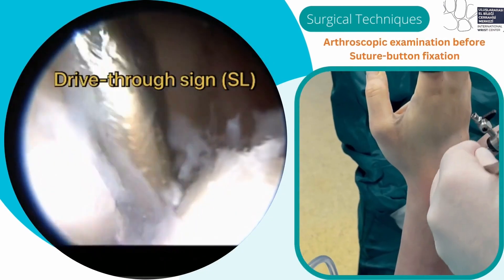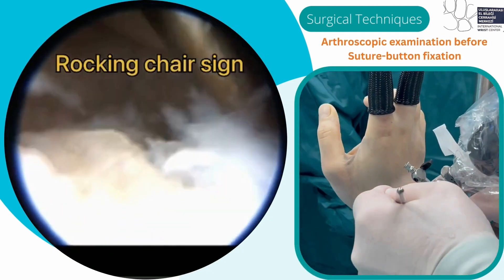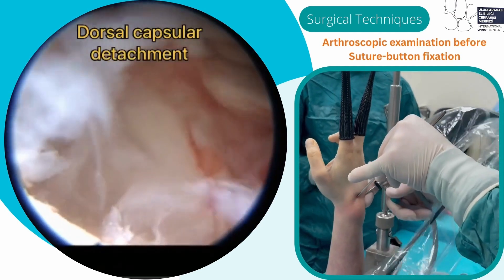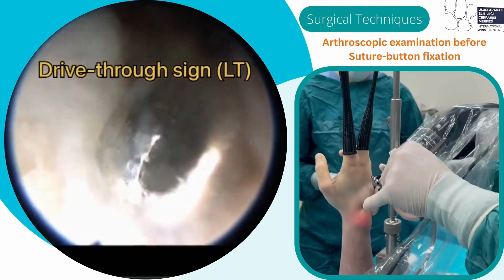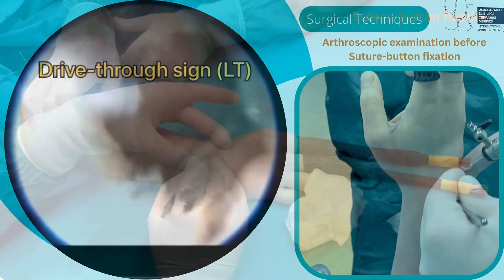Arthroscopic examination on MCU portals shows Geissler Grade 4 SL injury, evident by the positive drive-through sign over the SL joint, LT step-off, floating lunate with rocking chair sign, and drive-through sign over LT.